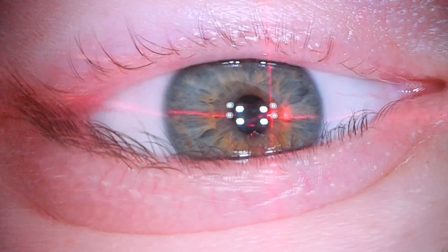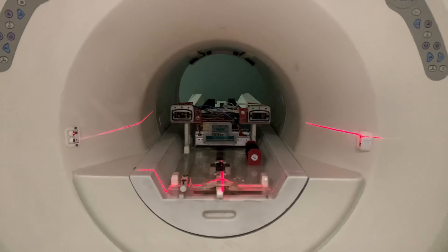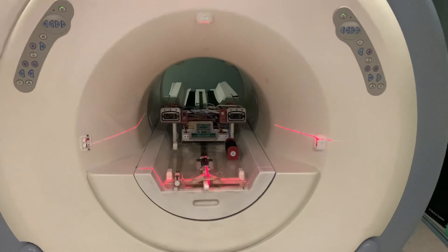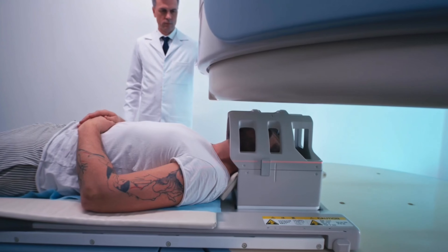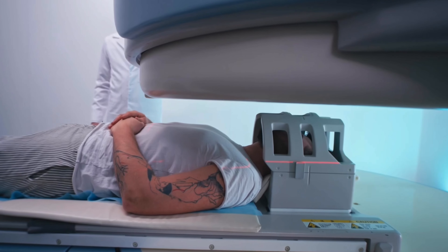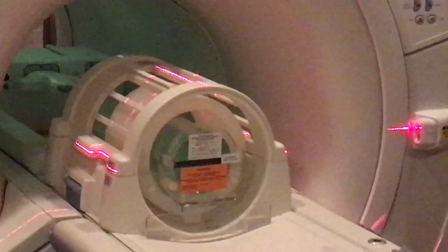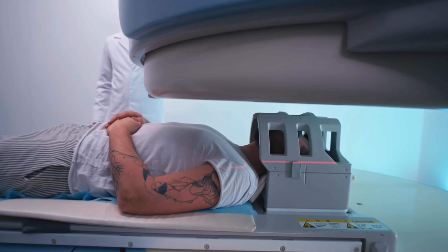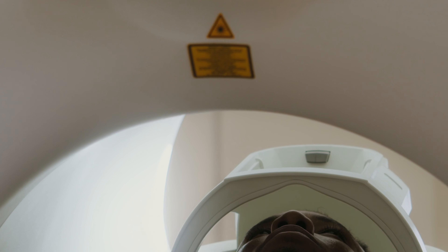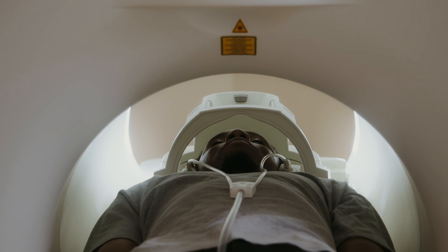Class II lasers emit a visible light wave that is less than 1 milliwatt in power. They are classified as safe for unintentional exposure for less than a quarter of a second. Class II lasers do not pose a skin burn or material burn hazard, but they can cause temporary blindness or damage to the retina and damage to the cornea. It is best practice to keep your eyes closed during the landmark process to eliminate the risk of accidental laser exposure.